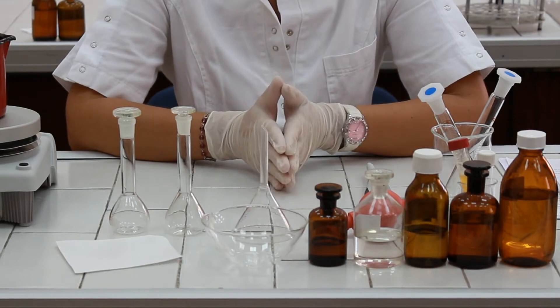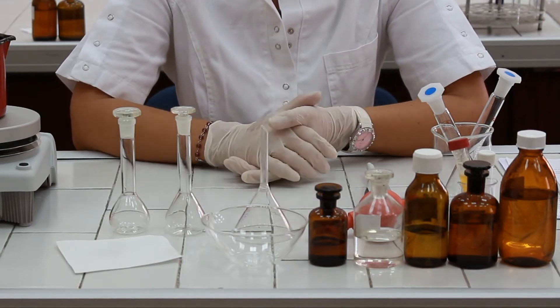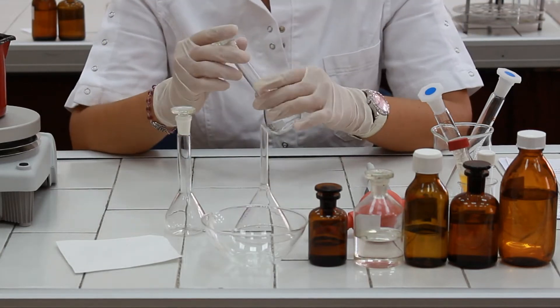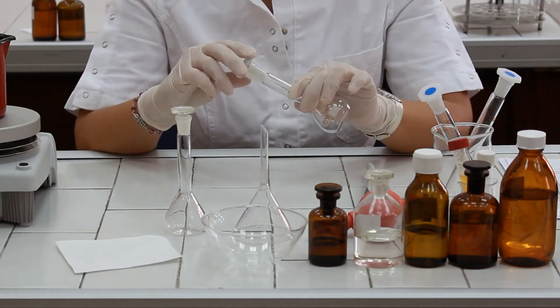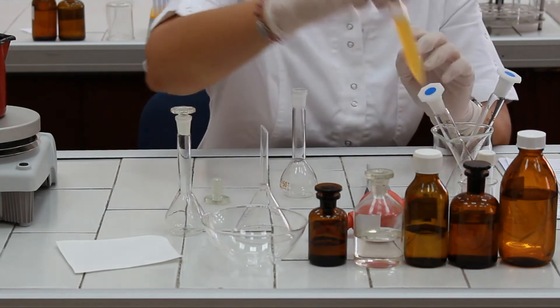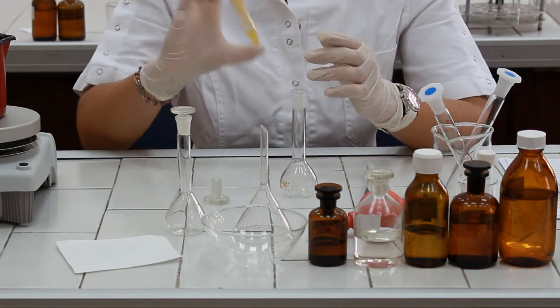At the beginning of the experiment, the first step is to extract cholesterol from the blood plasma. In order to do this, we are going to take the volumetric flask and pipette one milliliter of blood plasma sample.